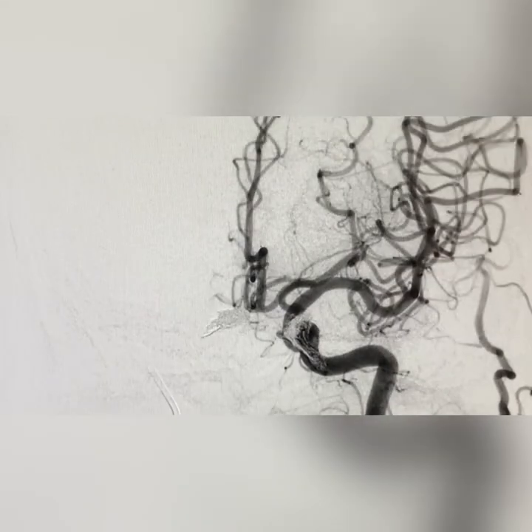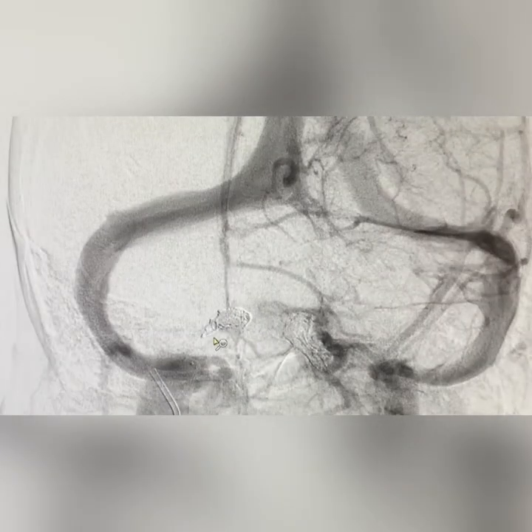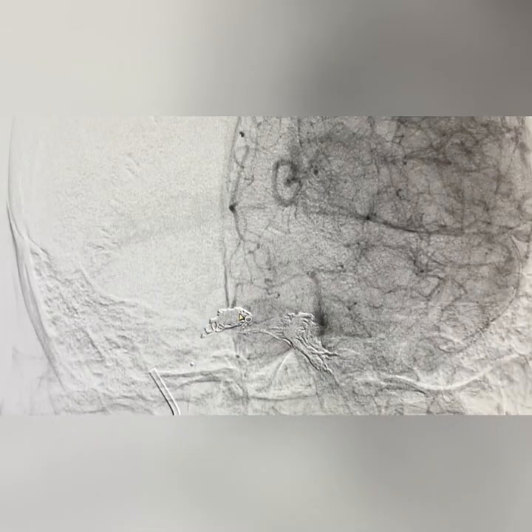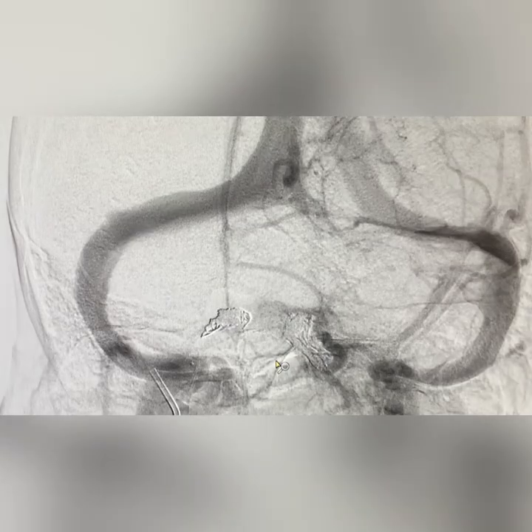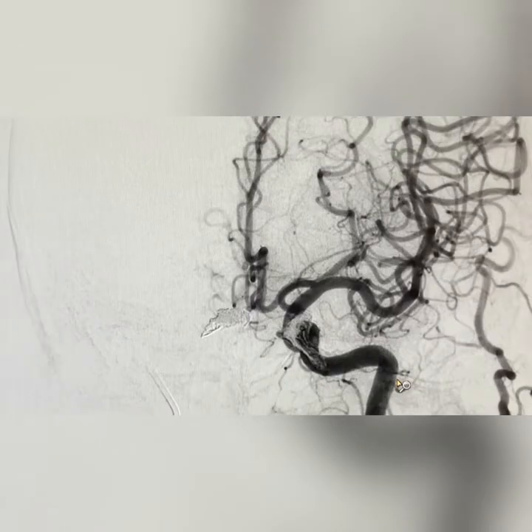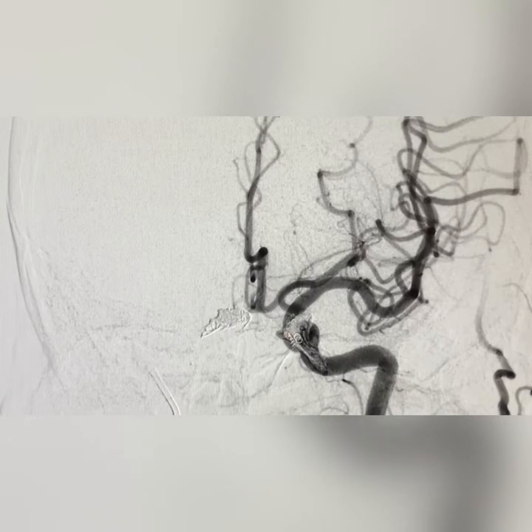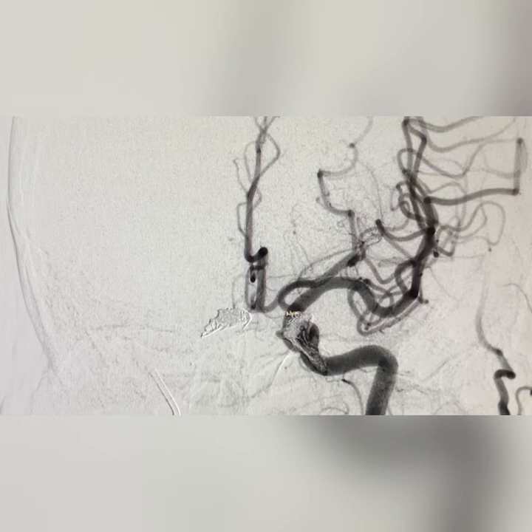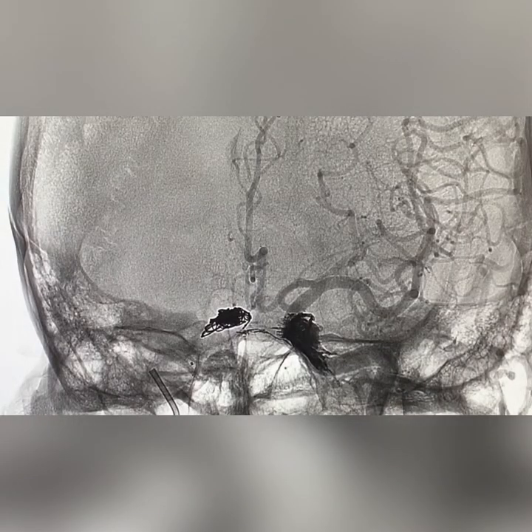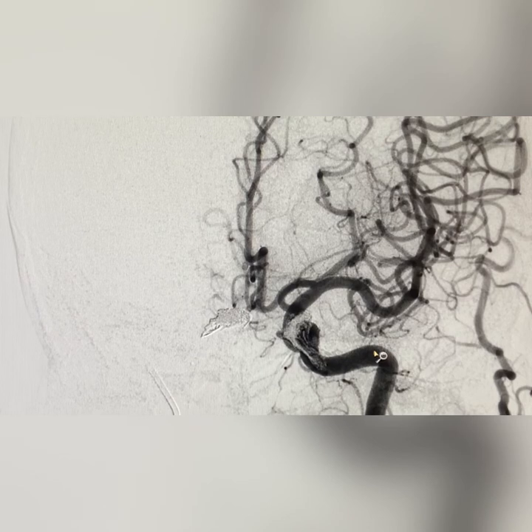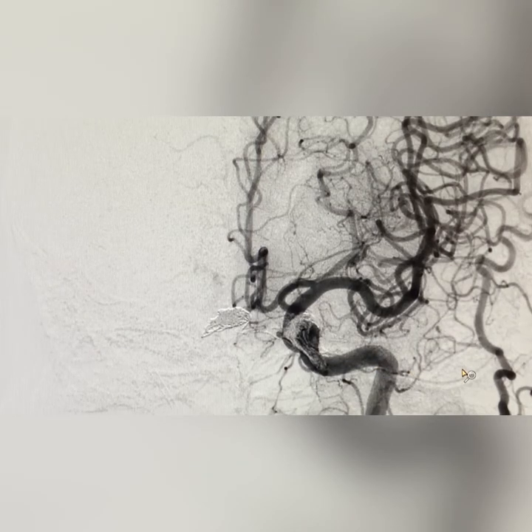The cerebral parenchymal filling is intact and doing well. This angiogram demonstrates that the carotico-cavernous fistula is completely cured — there is no opacification of the carotico-cavernous fistula whatsoever. That is the endpoint where we stop embolizing. Frame-by-frame review of the left common carotid artery injection shows both the left and right cavernous sinus embolized completely. The non-subtracted view clearly shows the embolic material within the cavernous sinus, completely excluded from the circulation.